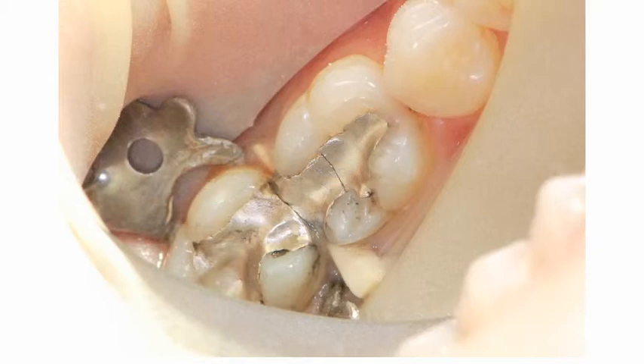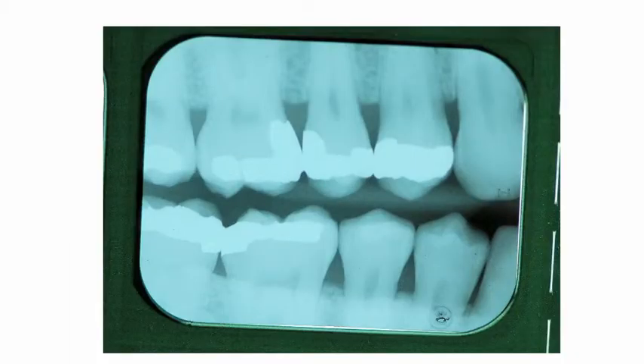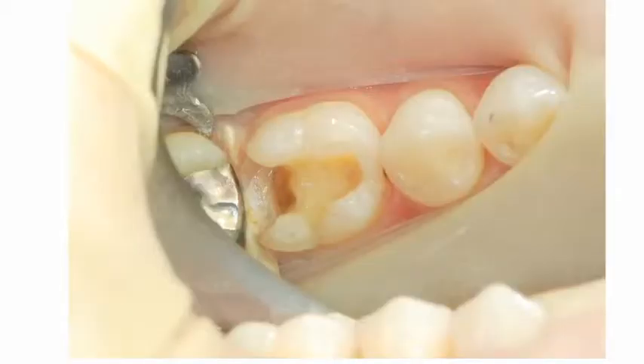This patient presented with a failed fractured amalgam in tooth number 30, the lower right first molar. The radiograph confirmed recurrent decay directly under the fracture, and the patient requested a white, tooth-colored filling. Once the old filling was removed, there was a moderately large box that needed to be filled, and utilizing a separating ring would be difficult, if not impossible. If placed directly over a conventional wedge, the matrix band would get crushed into the box.